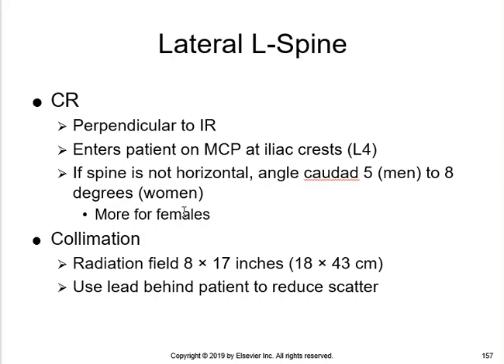So in the T-spine, our angulation was greater for men, but in the L-spine, we're going to angle caudad. We angled cephalad for the T-spine. We're going to angle caudad for the L-spine, and our degree of angulation is going to be greater.